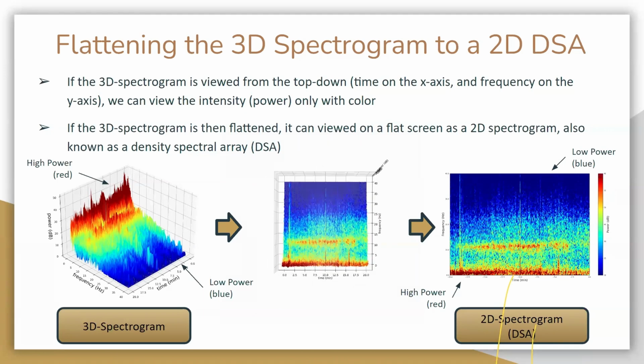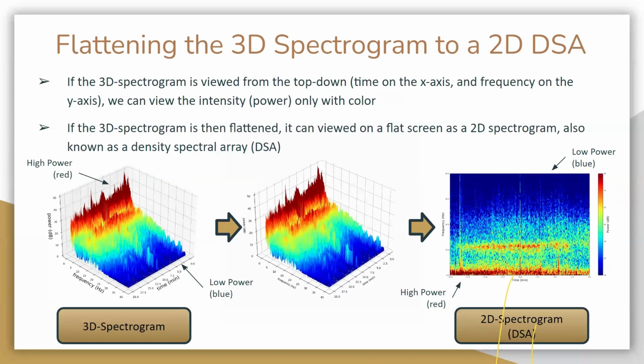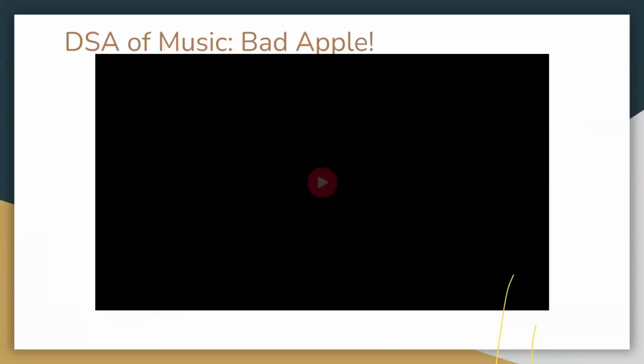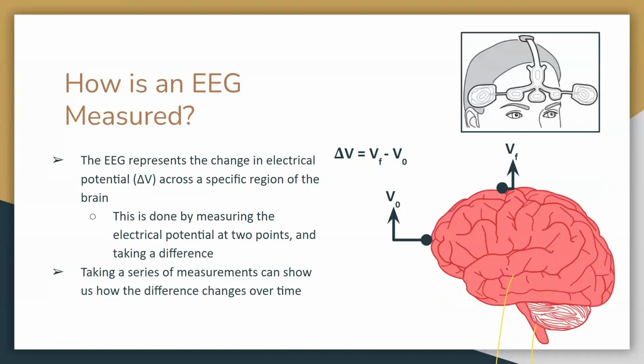It's a difficult question for reasons that you probably don't think. One of the things about working in decibel units is typically, let me skip forward a few slides. Sorry, I have lots of videos. Come on, almost there. There we go. So the way that we're actually measuring this data is I'm measuring voltages. I'm measuring the electrical potential at one point, the electrical potential at another point on the patient's skull, and I'm subtracting them.